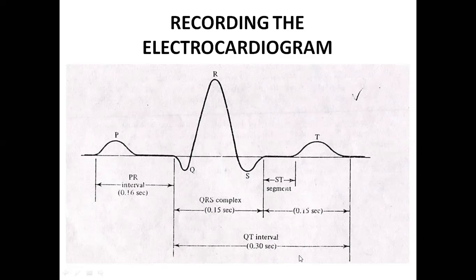Because he knows the standard values. He has the knowledge of these time intervals. If the record shows some other intervals, then he will say you are not well, your heart functions are not well, and you need to undergo some treatment, firstly by giving some medicines, then if it is not solved, then surgery and so on. Is it clear now how a person can be diagnosed as not healthy from this PQRST curve or the electrocardiograph?